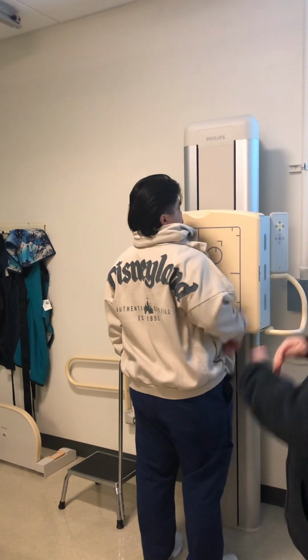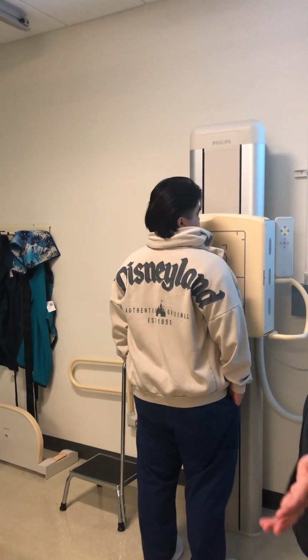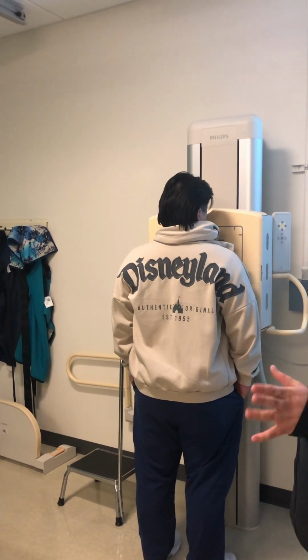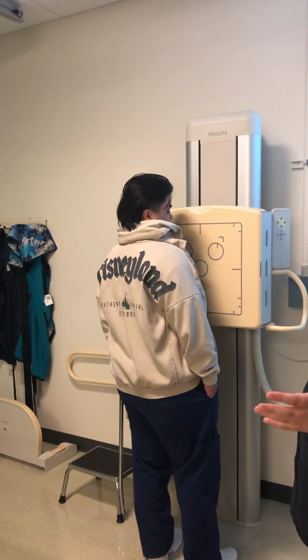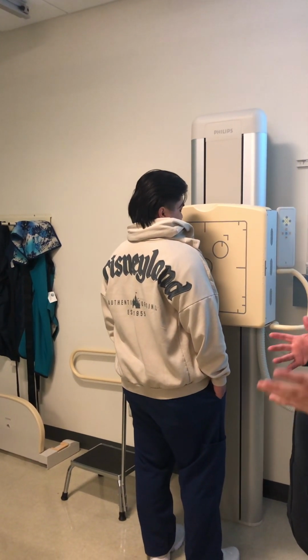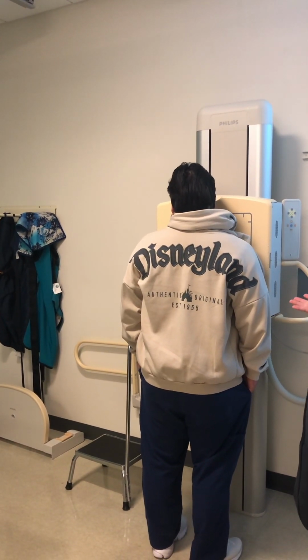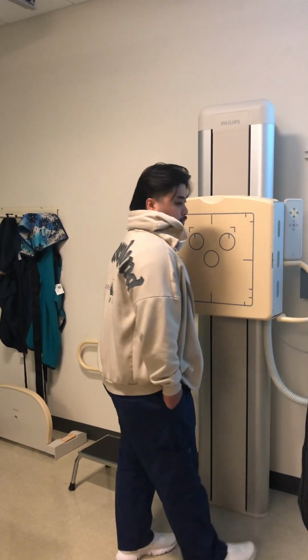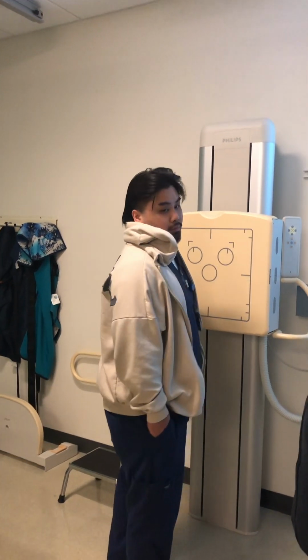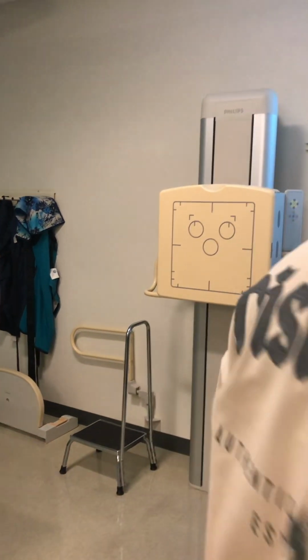Okay. I did not choose to go into 40. I left it at 72, but you can come in if you would like. Same thing goes for the ribs. I think the ribs are also kind of that option. Some people do them at 40. Some people do them at 72, because we get used to doing chest things at 72. Again, as long as your technique matches. So, yes. If you bring it into 40, your centering shouldn't change all that much. Correct. You're just going to play with collimation a little bit. That's pretty much it.